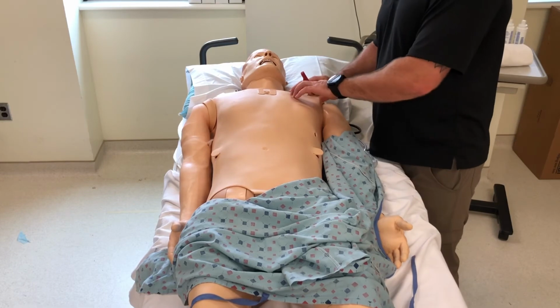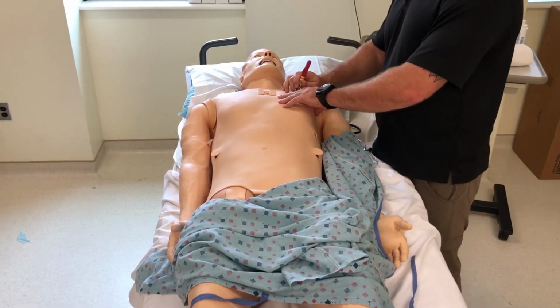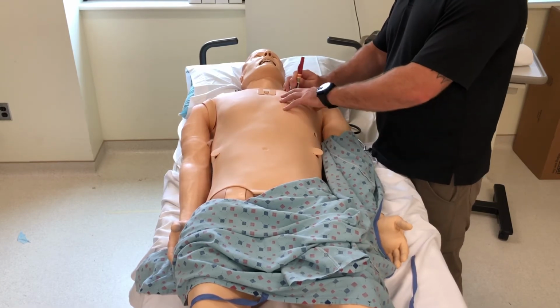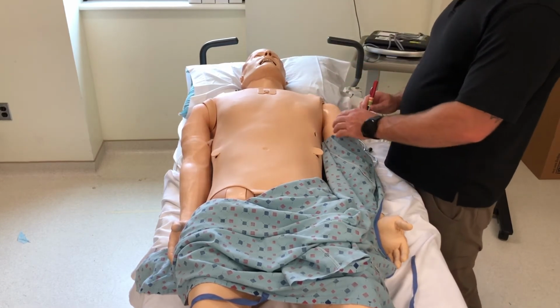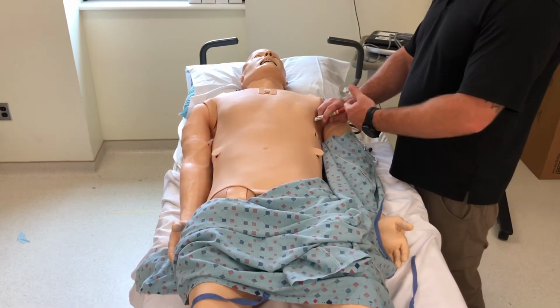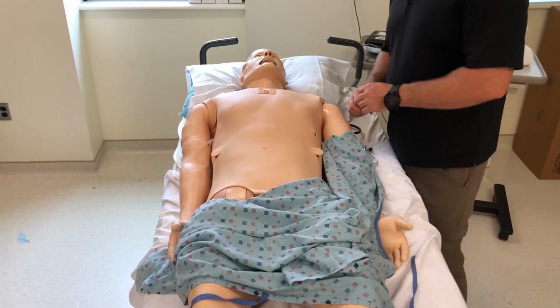So midclavicular line, second or third intercostal space. I'm going to go anterior to his chest. I'm sorry, not anterior, but perpendicular to his chest. Put that in there. Feel that whoosh. If that doesn't work, I can go to the anterior axillary line, the 4th or 5th intercostal space. Put that bad boy in there. If I hear whoosh, insert it in. Make sure you're using your 14 gauge 3.25 needle.